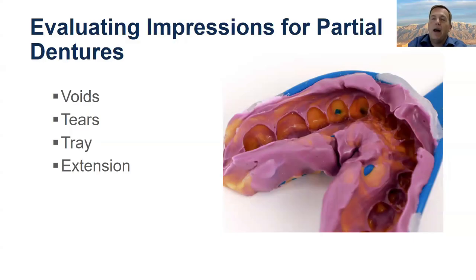So I think it's a viable solution if you're worried about the accuracy in that area, but if you think the impression is good, I'd say go with it. I just feel like the chances of inducing inaccuracy are much greater than the chances of making things better.